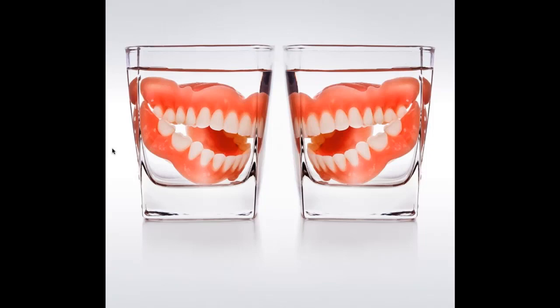A lot of doctors ask me, if the patient has a denture that they already love, can I duplicate that? That is not true. You cannot take a patient's existing denture unless it was already digitally produced and duplicate it precisely. I tell people you can get to 90% by using a digital process, but you cannot 100% duplicate a denture unless it was already digitally made. Then you can.